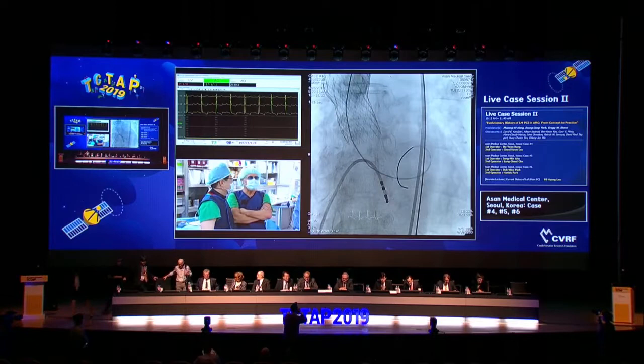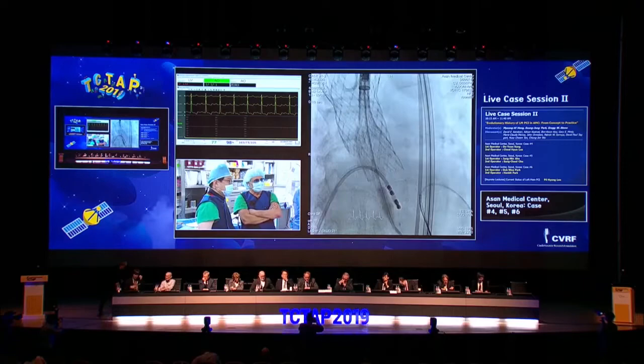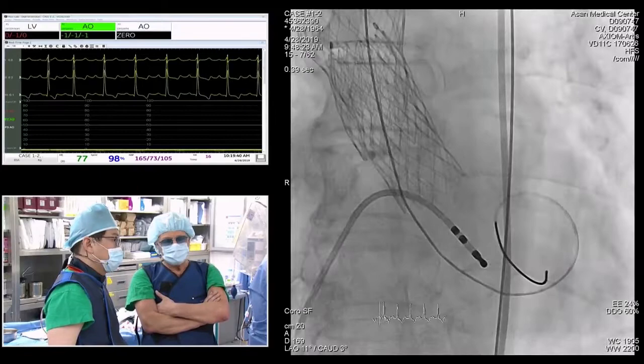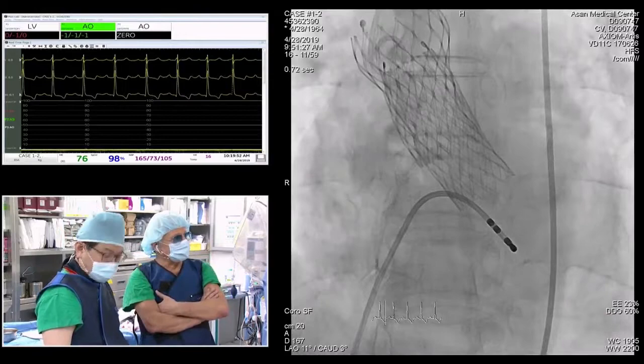What we basically did was take the second valve, the regular Evolut R. Noteworthy, the Evolut R passed the bifurcation very easily. So in retrospect, it's important that even one French makes a difference. We placed it at the expected depth between 4 and 5, and the previous valve moved up a little bit. We didn't push down, but rather it moved up, and the result of the second valve was actually very good.